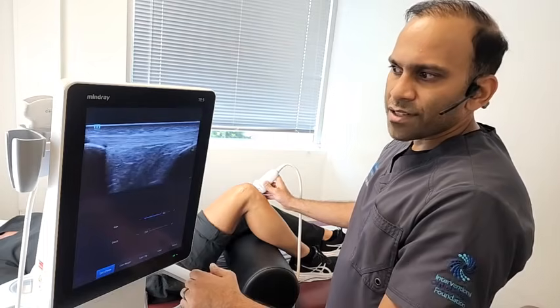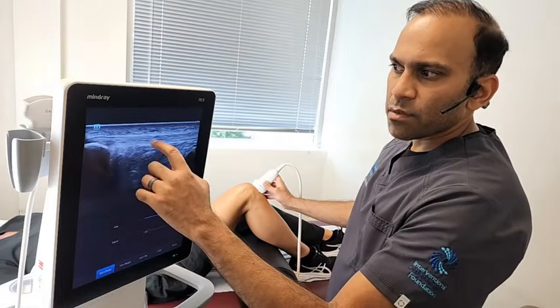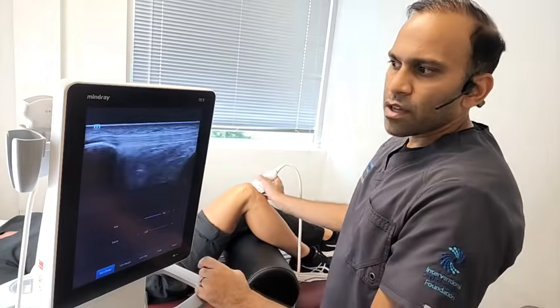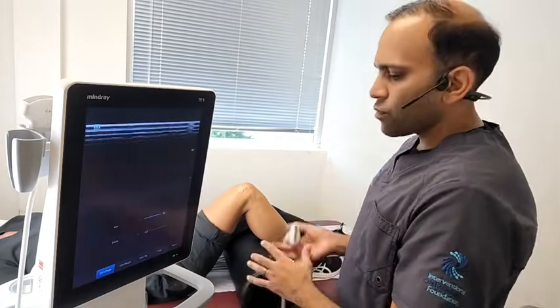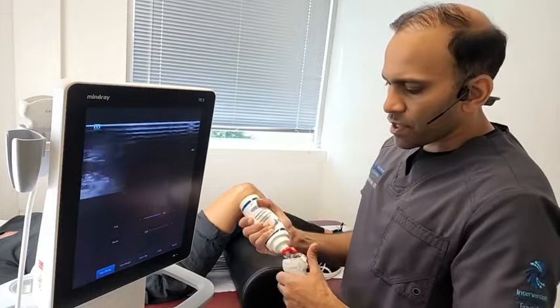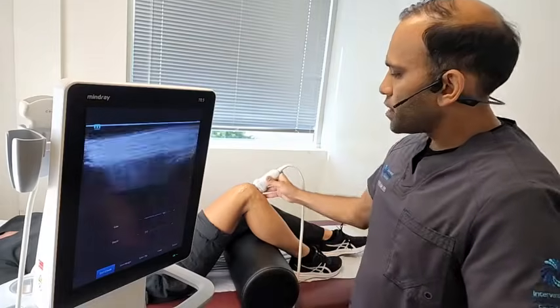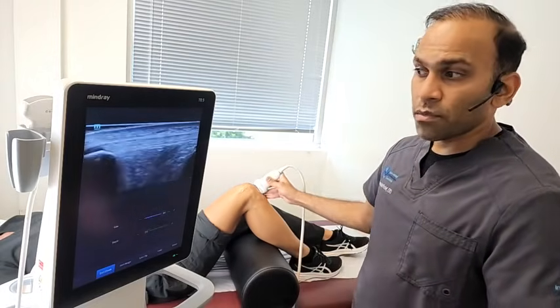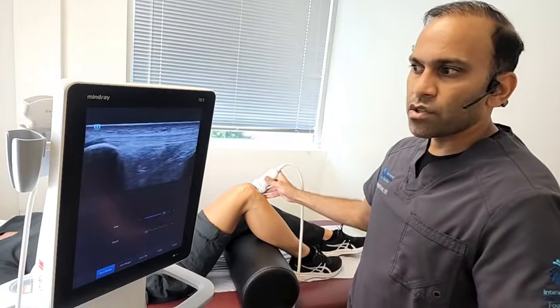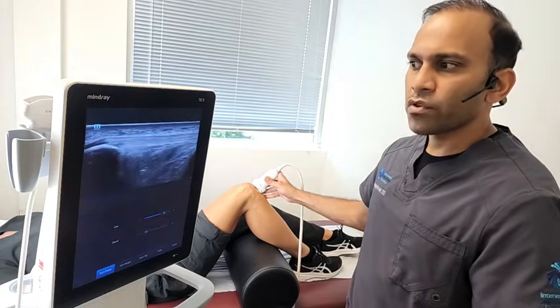You're starting to see a little bit of disorganization in areas here. See these areas where it's a little bit darker. These might be areas of a little bit of what we call tendinopathy. Now, tendinopathy is when the tendon fibers get disorganized. This can happen normally as we get older and as we're doing a lot of activity, or it can happen if we're not moving correctly.